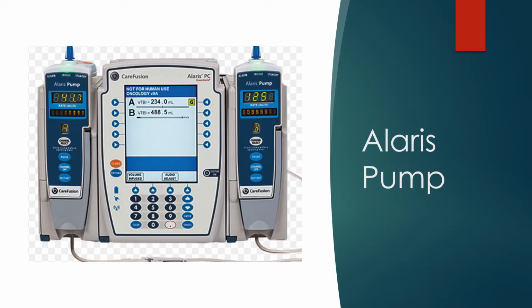This is the Alaris pump. It's also another big one that you'll find or see a lot in your nursing career. Both of these pumps are smart pumps. The idea of a smart pump means it will check your medication, it will verify compatibility, which we'll talk about shortly. If you're going to run multiple medications and you program them into the pump, it'll check your rate, make sure that it's correct, and that if there are multiple items, they're compatible. So it's really a double check so that you're following the rules and keeping your patient safe.